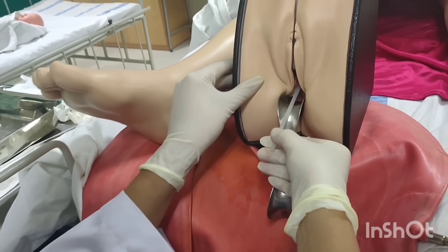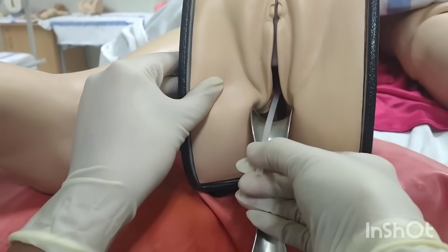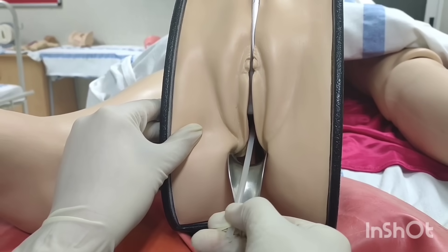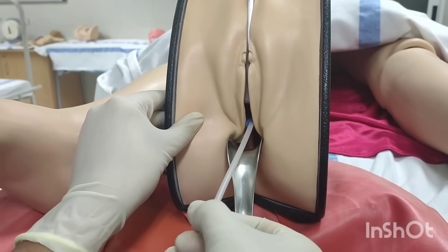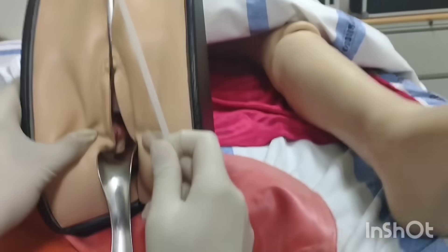After pulling the plunger, push it again inside a bit, then by slowly, in circular motion, pull it outside. You have to check for the visible threads.